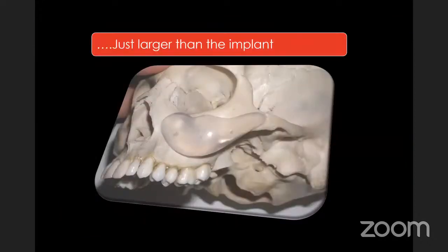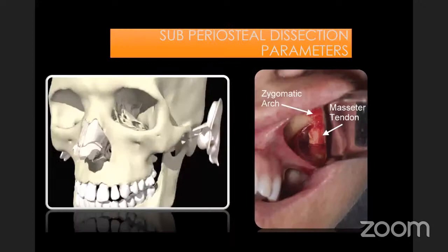So the implant sits in approximately this position, and you don't want to have a very large pocket for your implant. You want your pocket to be just a little bit bigger than your implant. Otherwise, you will have problems with dead space and possible movement. The submalar implant pretty much sits in this type of position.